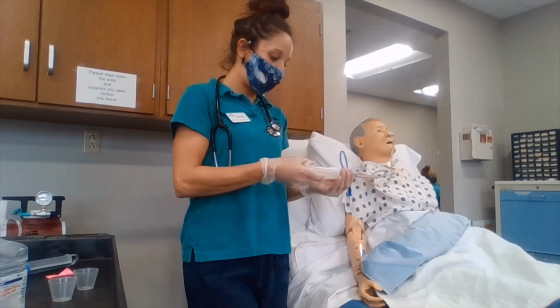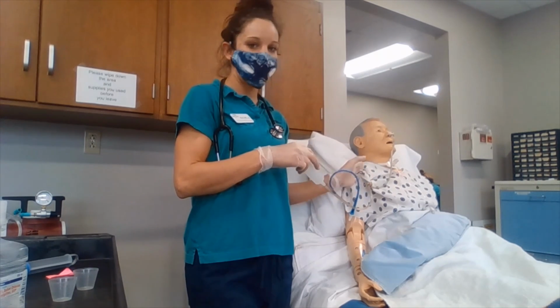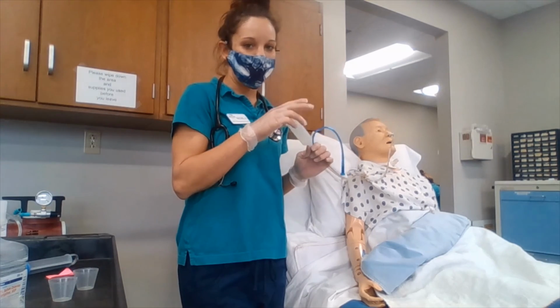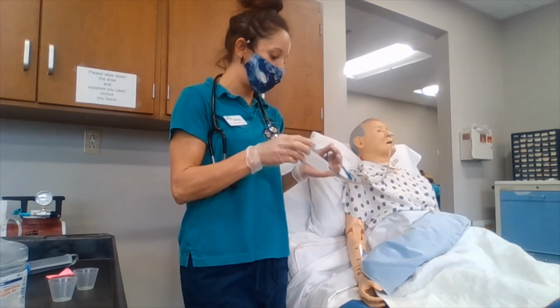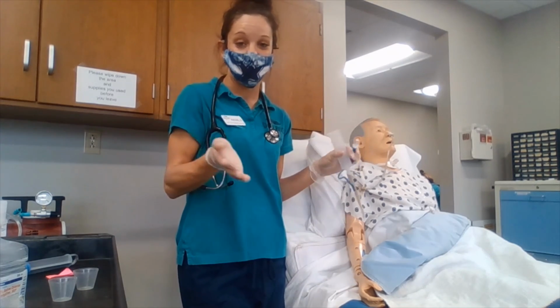When we are done, we are going to have the patient sit up in high Fowler's for about a half hour. We are not going to attach the suction device for another half hour, or for a half hour as well.